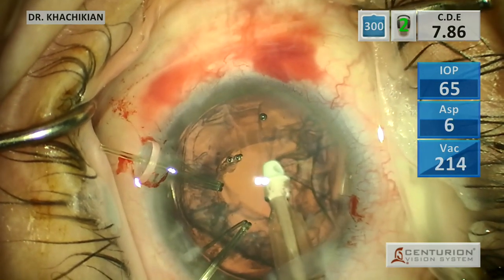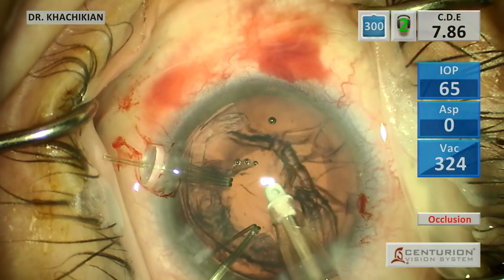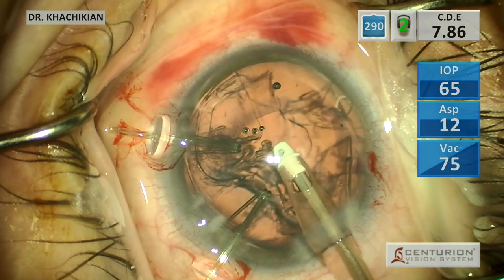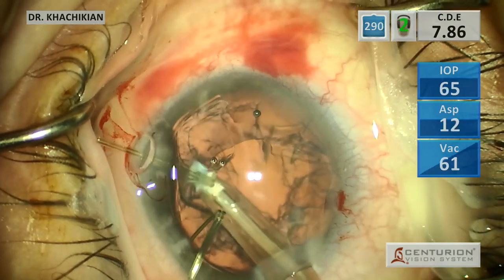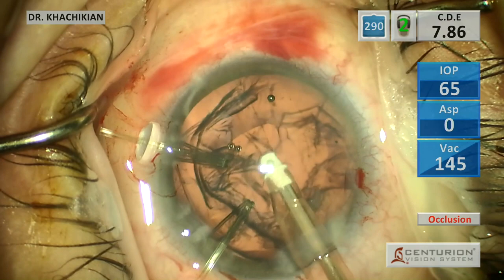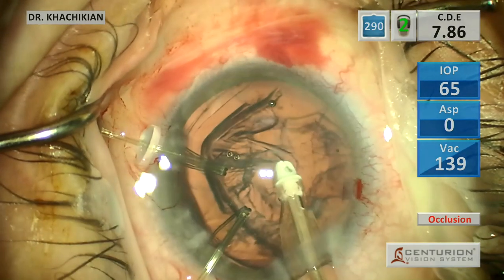Now we're on cortex removal. Just gently - we've got to be gentle because again, we don't know how loose that capsule is going to be. It looks like inferiorly there's pretty good zonular support. You're just really learning this throughout the case because you don't know going in. And superiorly there's some support there, but look at that - superiorly, there's not a lot of zonular support right up there.